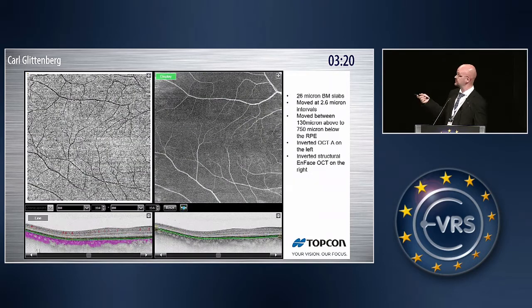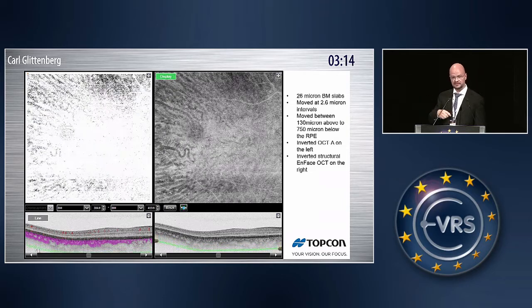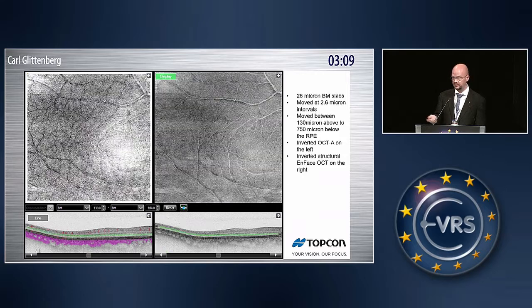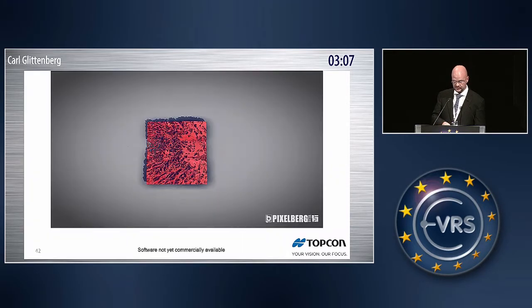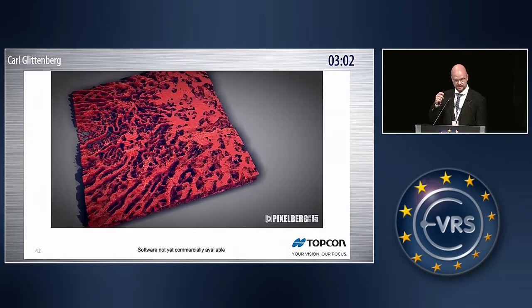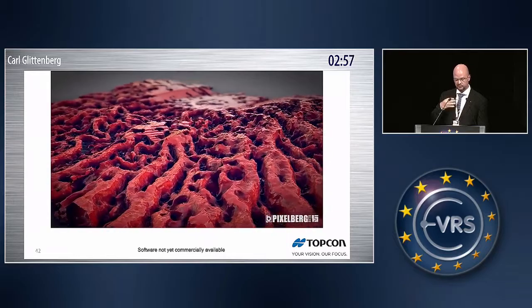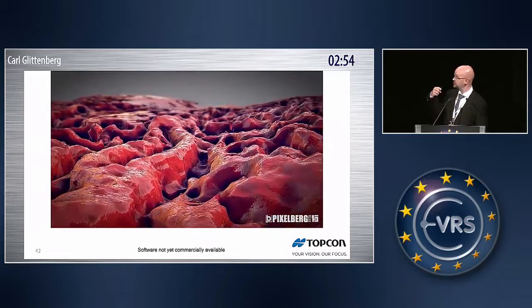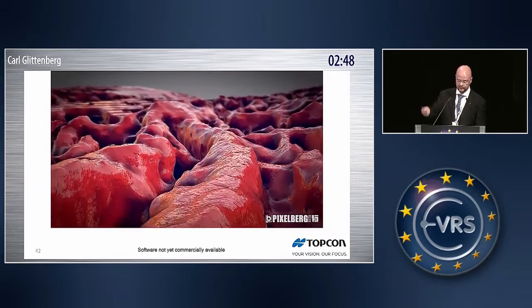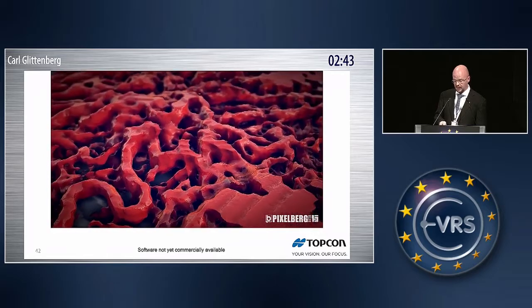So let's go back to this patient with a scleral bulge, and you see this little squiggly vessel here, and I wanted to see how far can I visualize it. Now what you're about to see now has no clinical value, but I wanted to do it as a proof of concept. So I took that data set and I segmented it in the three-dimensional segmentation, again so that we can get a difference between stroma and vascular structure, so we can really visualize it, but also so that we in future perhaps can use this for fluid dynamic simulation and volumetric analysis and artificial intelligence analysis.